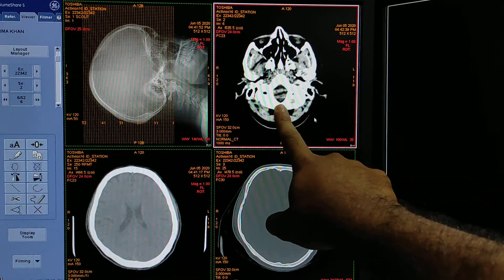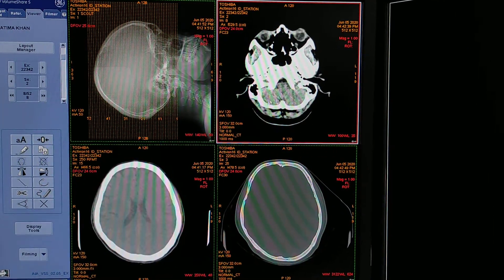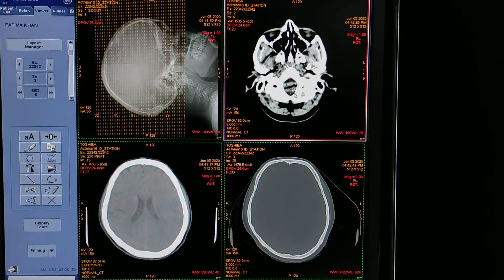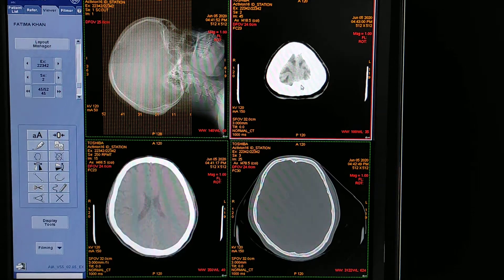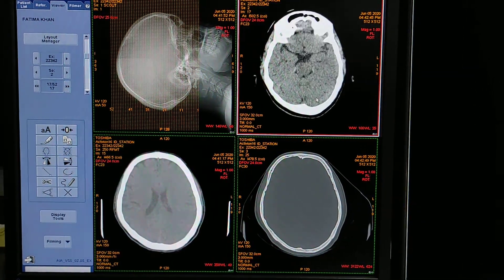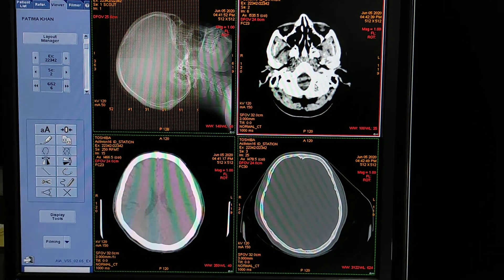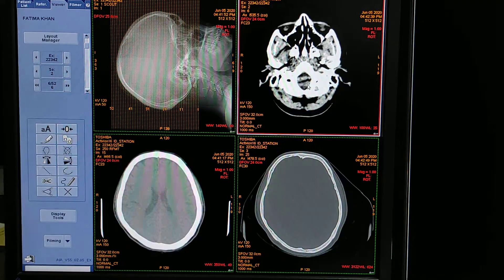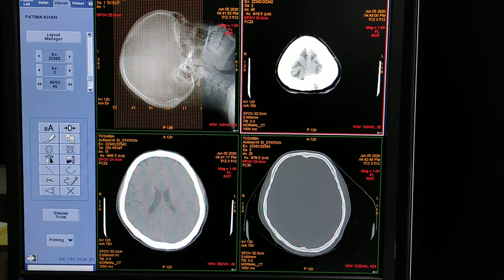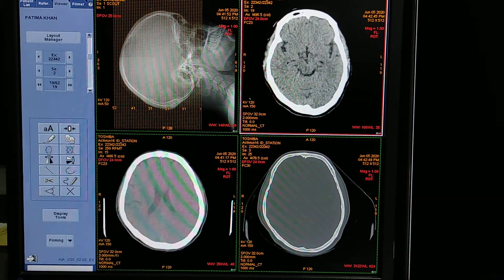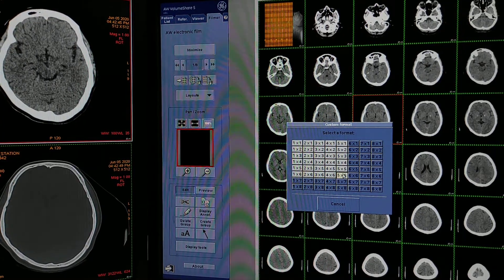From here you have to start — you should give the first image from here. The next image is where the cerebellum is going to start; this is the cerebellum medulla, so this should be your starting point. The ending point should be over here at the high frontal parietal region — keep this sinus in mind. In the soft tissue window, this should be your starting point, and the ending point should be over here where the sinus ends. Select the 30-image format — click on the custom 5x6 format.